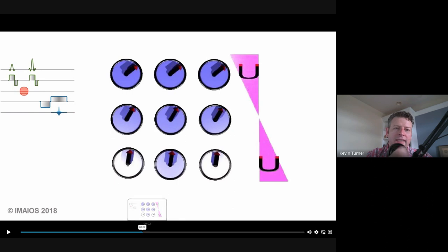So when we talked about phase last week, we talked about how phase is the difference of where protons are pointing. If I change precessional frequency, and if you see the gradient right there, that symbol right there up top, right, that's the gradient, the pink triangles. There's the positive side up top making the magnetic force stronger. In the middle, you can see the magnetic force is not changed, isocenter. And down here, the gradient has made the magnetic field slower. Which means when the gradient turned on, protons in the positive side of the gradient started moving faster, and protons on the negative side started moving slower.